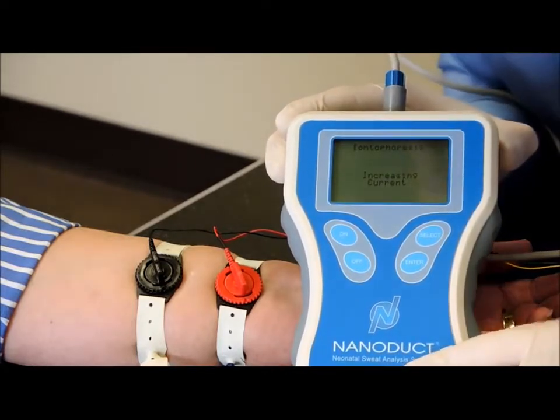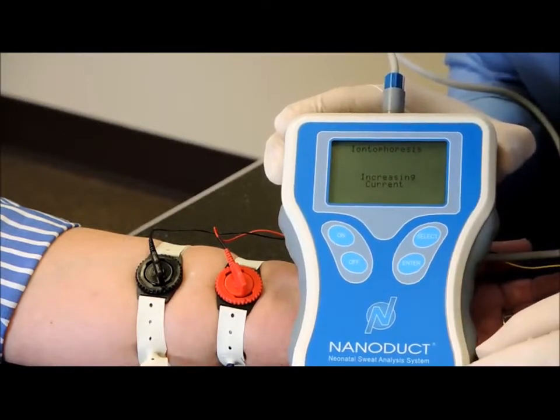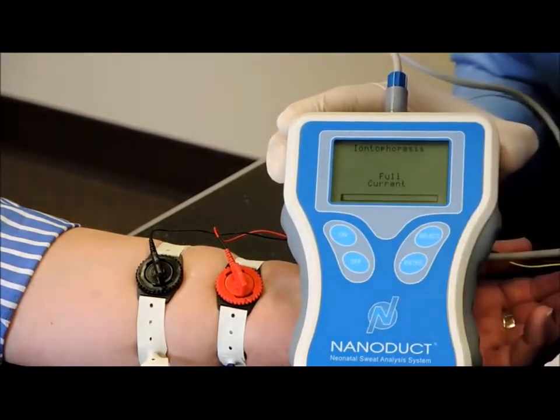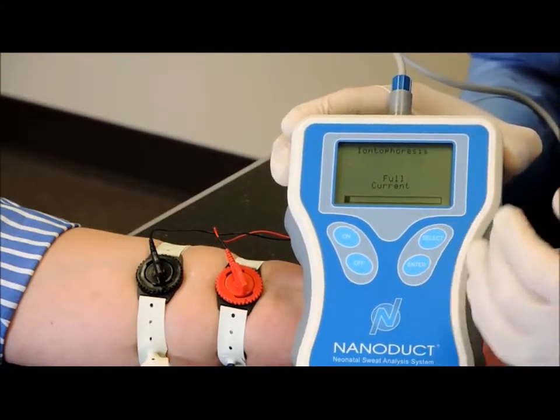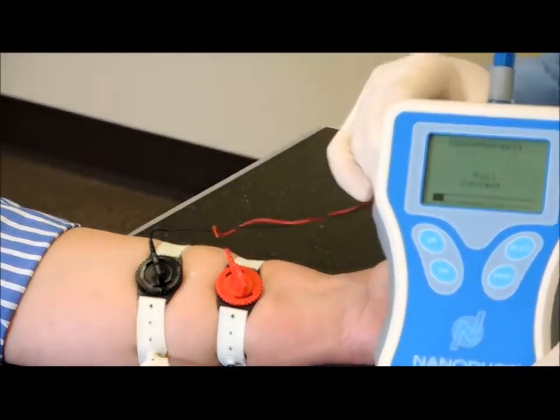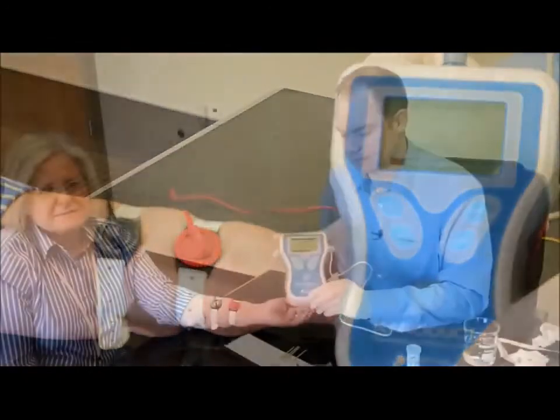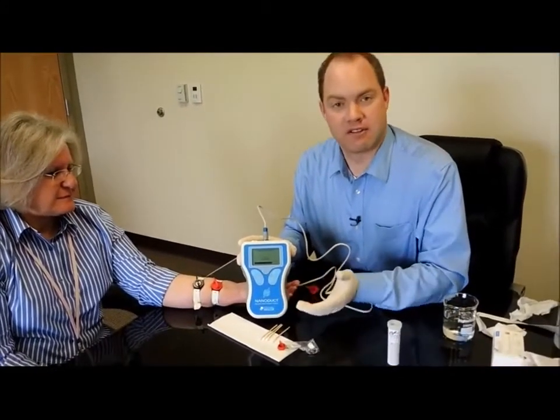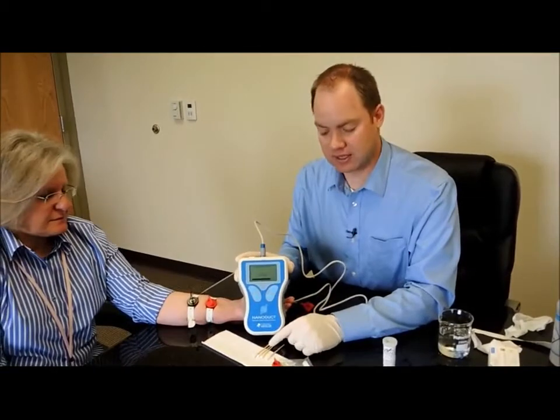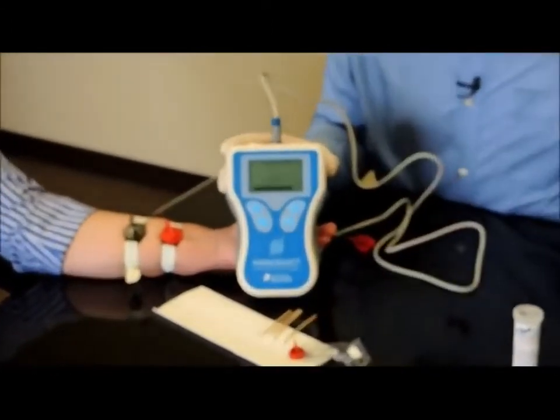Right now it says increasing current. And then it says full current now, and it has a progress bar going across. That progress bar is empty and gets filled up as it progresses. This is where the patient may feel a little tingling as the iontophoresis is occurring. While the iontophoresis is going, you can prepare a few of the supplies you'll need after the iontophoresis, like a few of the cotton applicator sticks, the sensor cell, and some water.